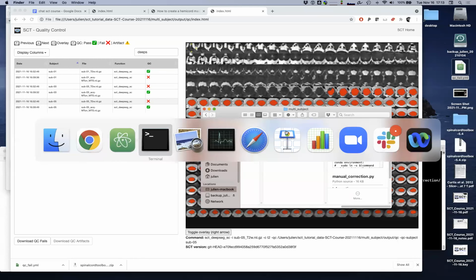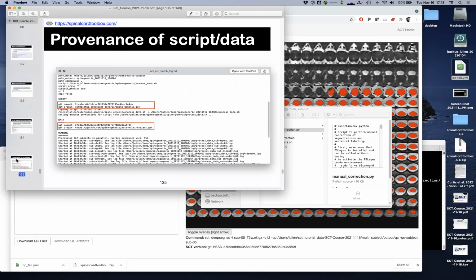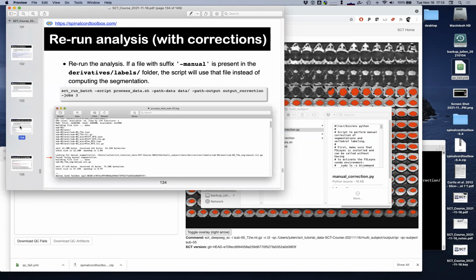Thanks. So that's something fairly recent. So we are still working on the procedure, and we would love to have your feedback on that approach, to make it more streamlined and accessible for the crowd. An idea that I have while you were going through this was, sometimes we like to have more than one set of eyes when something is manual.